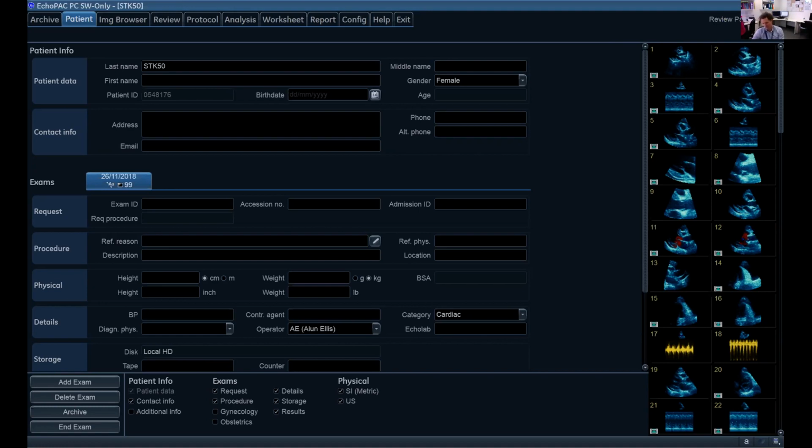And the features of tamponade that you might expect to see on 2D imaging essentially is chamber collapse, so right atrial and right ventricular collapse. And what phase of the cardiac cycle do those happen? Specifically, and I don't have them in my head right now.